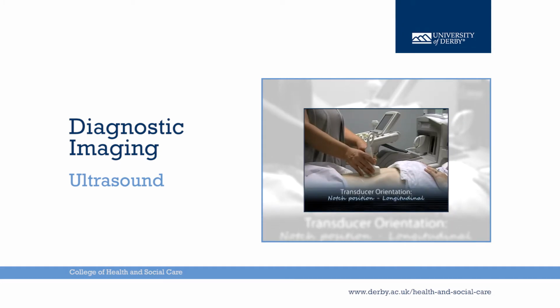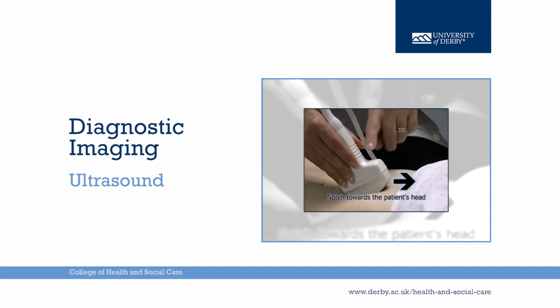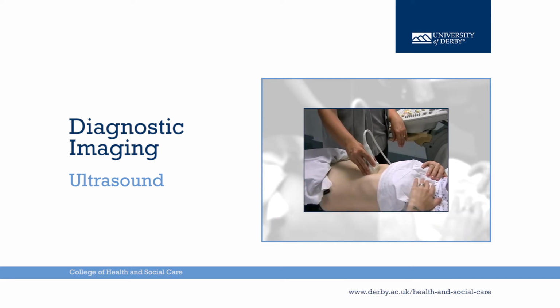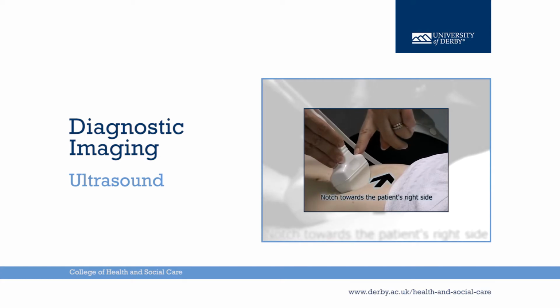Longitudinal. For a longitudinal scan, the transducer is held with the notch towards the patient's head. Transverse. For a transverse scan, the transducer is rotated anti-clockwise and the notch is placed to the patient's right side.